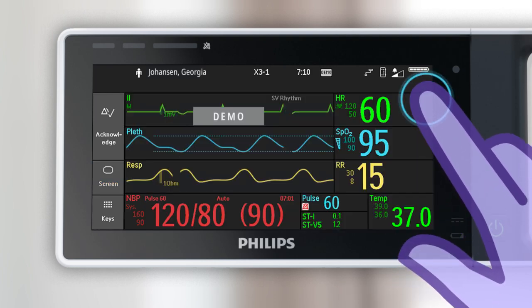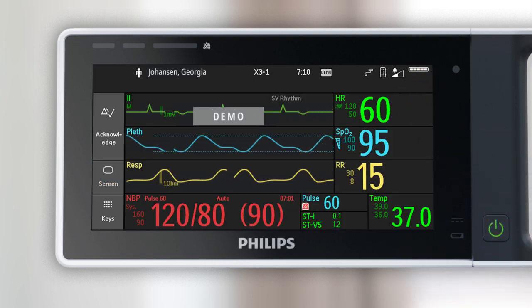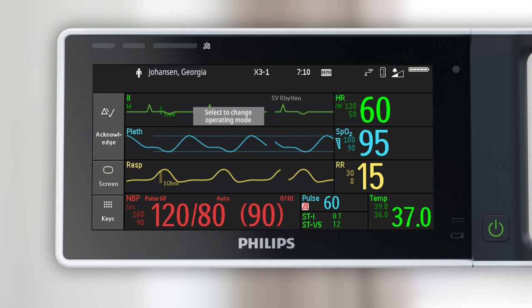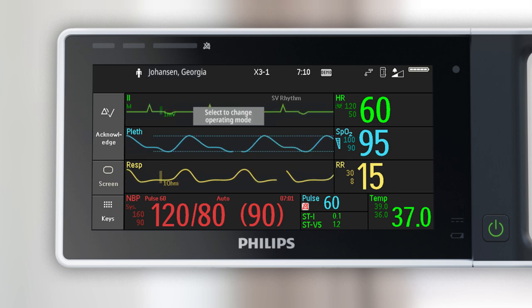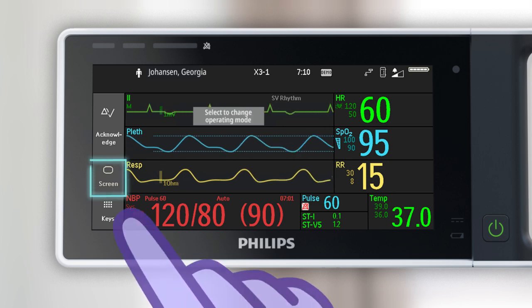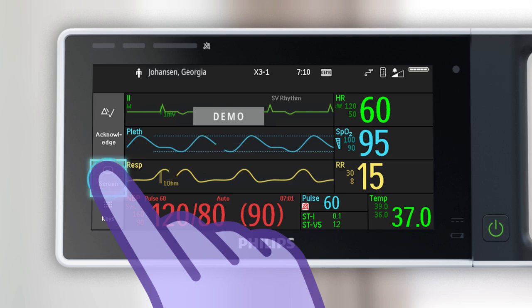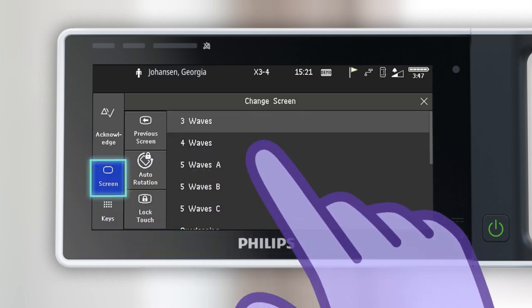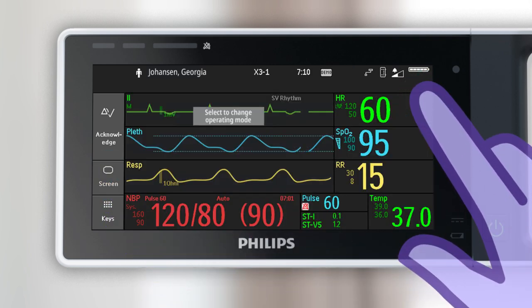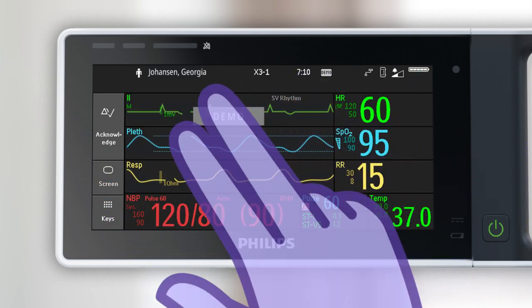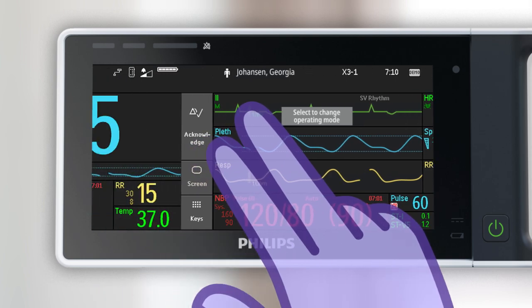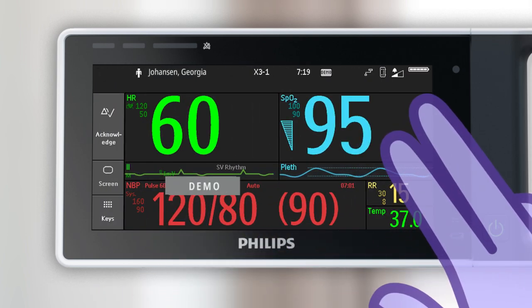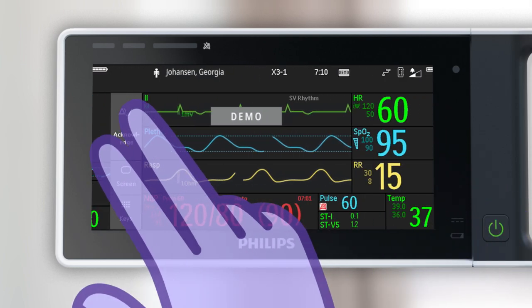Similar to a bedside monitor, the X3 also has different screen layouts. To switch to another screen, touch the screen permanent key to view a list of available screens. You can also change screens by using two fingers to swipe across the screen either to the left or right.